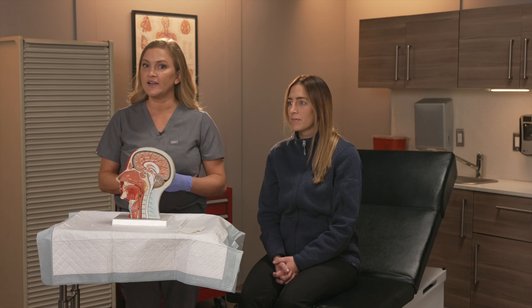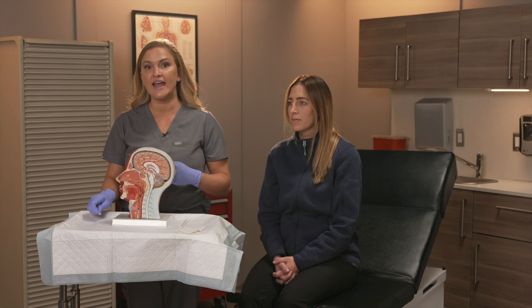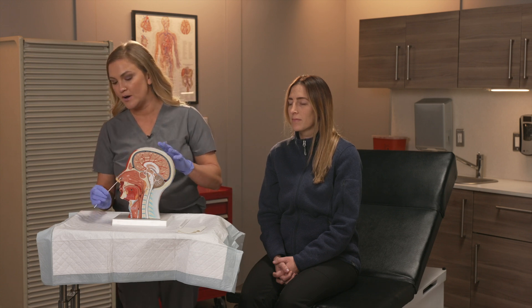For the anterior nasal sample, you want to collect your sample at the anterior most aspect of the nares, which you can see right here on this model.